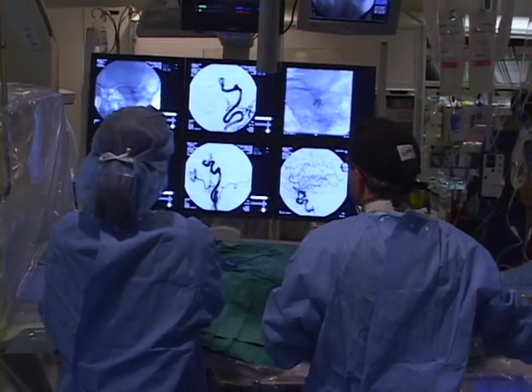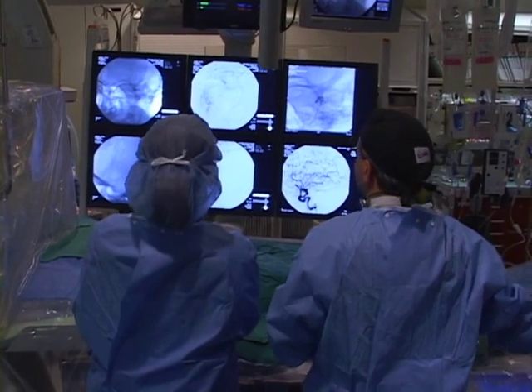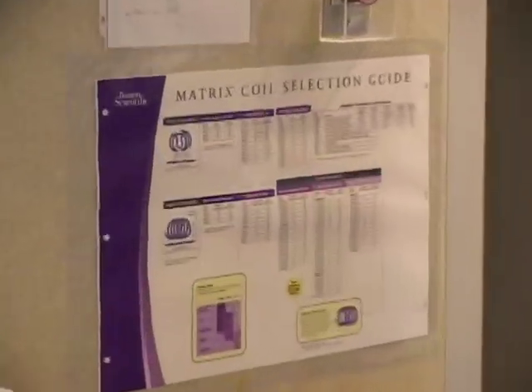Our preliminary experience with the 360 Matrix coil has been overall quite good. It is clearly behaving differently than the original 3D design and is increasing our flexibility for applications as both a framing coil and as a filling coil. You know, I think the Matrix 2 technology has allowed us to treat the aneurysm with a main coil from start to finish. Whereas before we would possibly use a 3D coil and then use some 2D soft coils and ultrasofts. We're still obviously using the ultrasoft technology with the Matrix 2, but at least in our initial experience, we're using them from start to finish, which I think is a unique advantage.